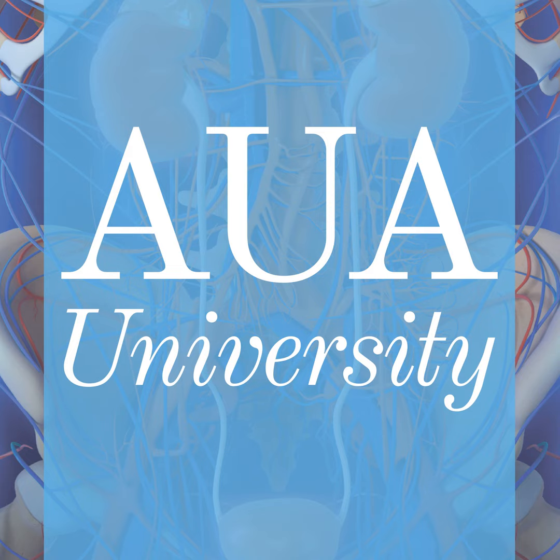Our nuclear medicine people are usually nice. They call it a PSMA lesion in the dorsolateral area of the bladder because they don't want to blame the surgeon. It's a seminal vesicle remnant, which should never be there. Because if you do a proper radical prostatectomy in this type of patient, you need to resect the seminal vesicles completely. Don't leave behind the tip of the seminal vesicle for whatever reason.